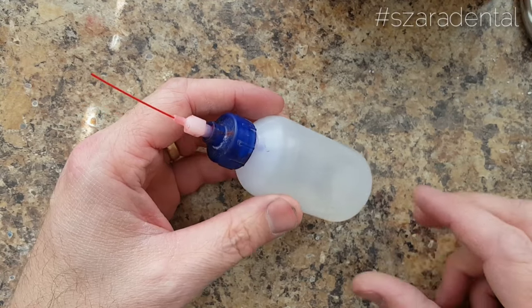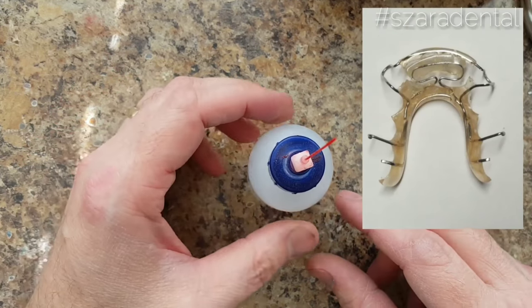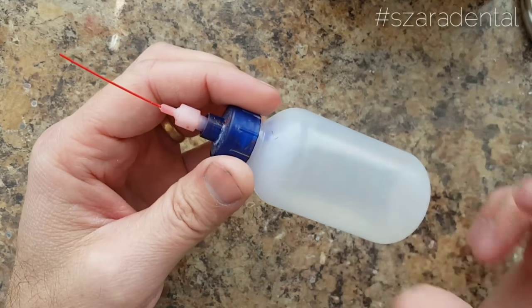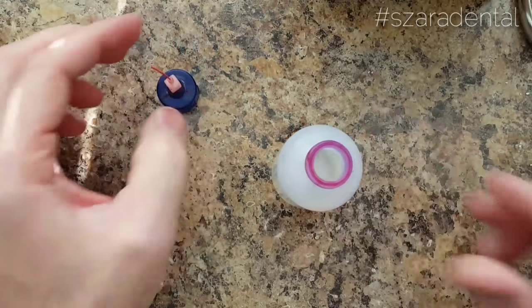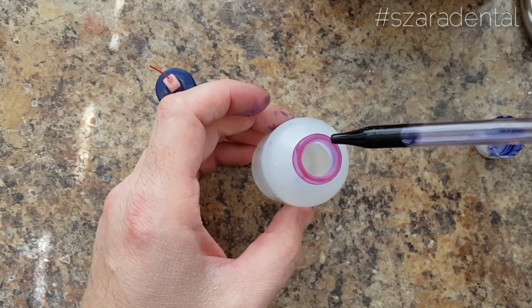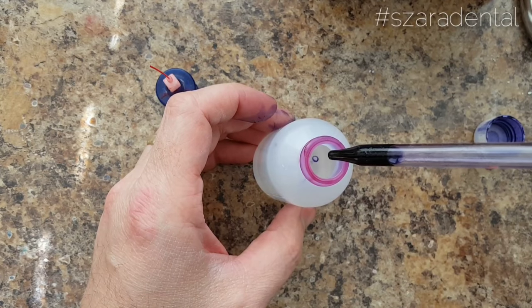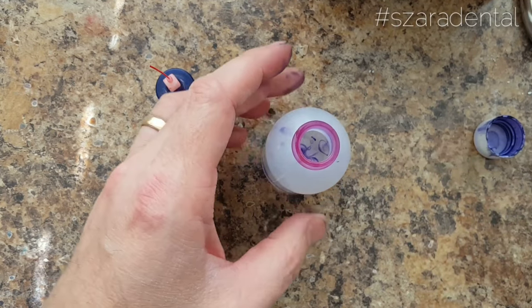Are you tired of getting yellow retainers and you want to know the secret of making a really, really clear retainer?